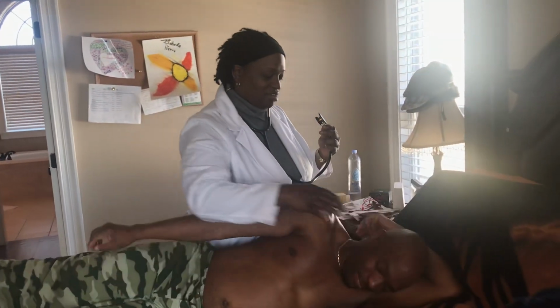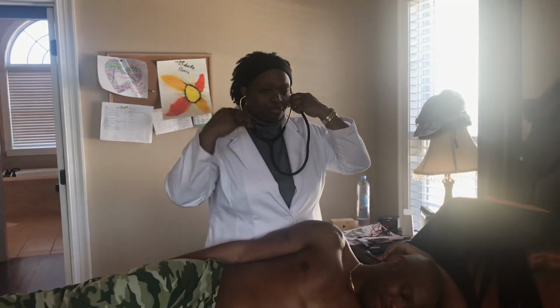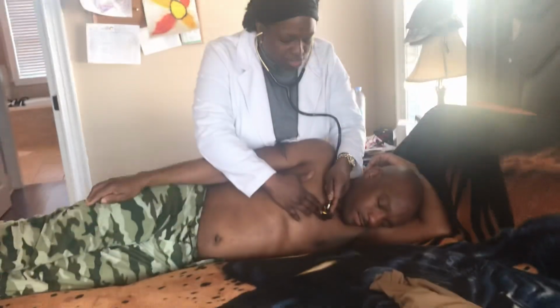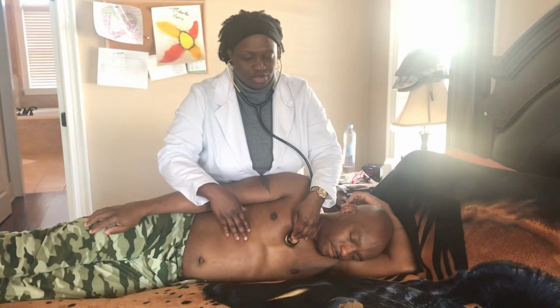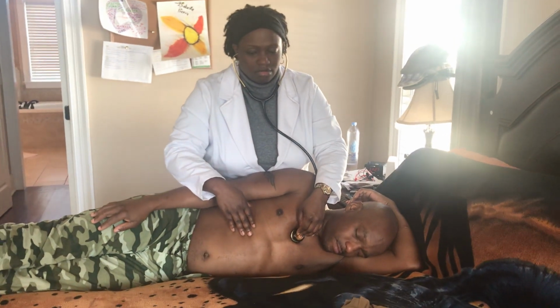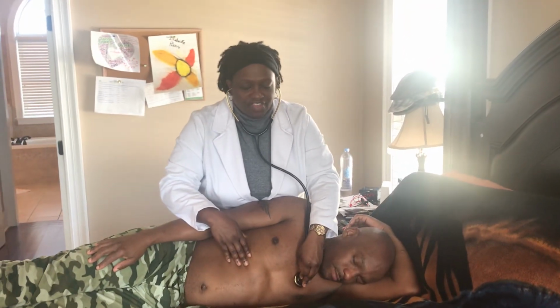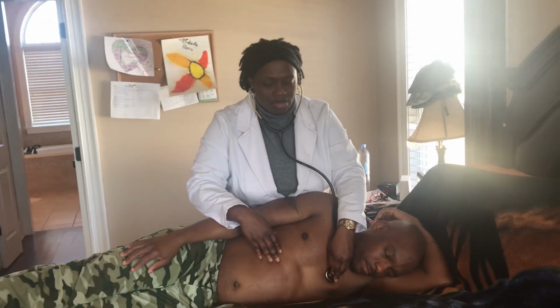All right, put your arm to the back, and we're going to listen again. Again, I'm having him turn to his left side because it's going to help bring the heart to the chest wall and help me hear it better. Okay, so the second intercostal space, right sternal border, the aortic region. I'm listening for any murmurs or anything like that, and I don't hear any abnormalities or any irregularities in his heartbeat.